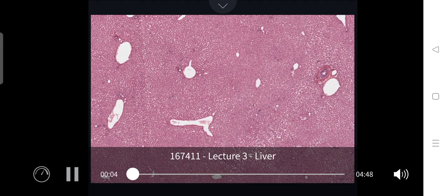The subunit organisation of the liver is very difficult to observe because the amount of connective tissue between lobules is minimal and the lobules are randomly orientated. Actually, the section of liver looks pretty uninteresting, but it is never easy to discern randomly sectioned lobular structures in pieces of liver such as this one.